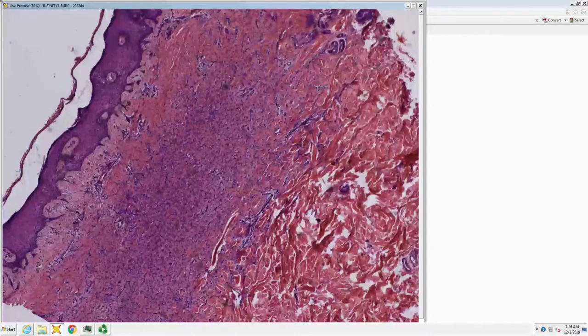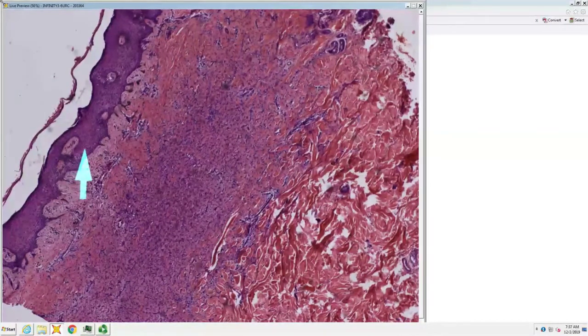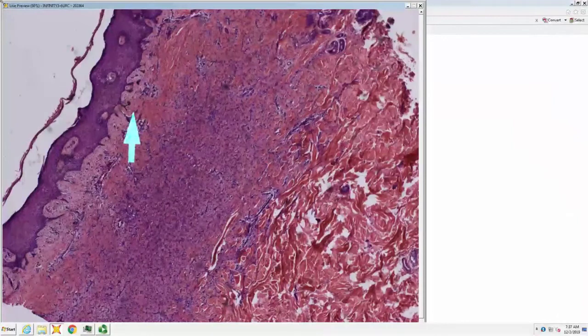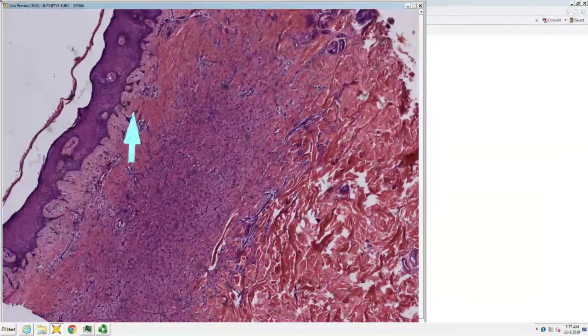Pretty. That's hypercellular, but there's a lot going on in the dermis. The overlying epidermis is attenuated or acanthotic? I would say it's kind of more attenuated. You think it's acanthotic? It's acanthotic. Okay. That's big. I misinterpreted your definition. Attenuated would be skinny. Yes, it is not skinny, it's fat. Yes, agreed.